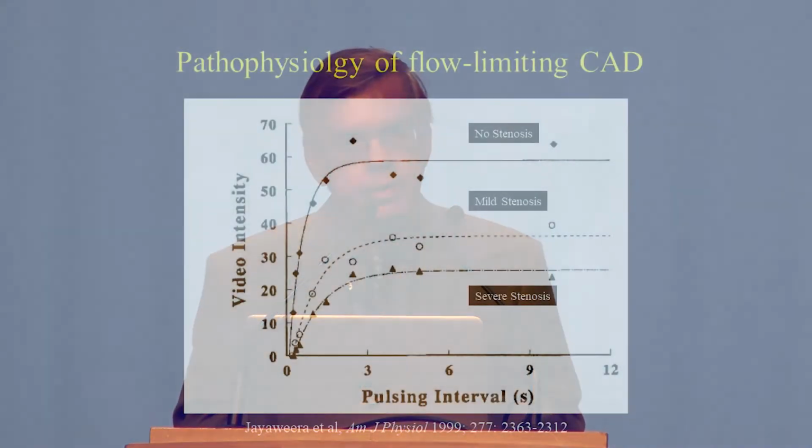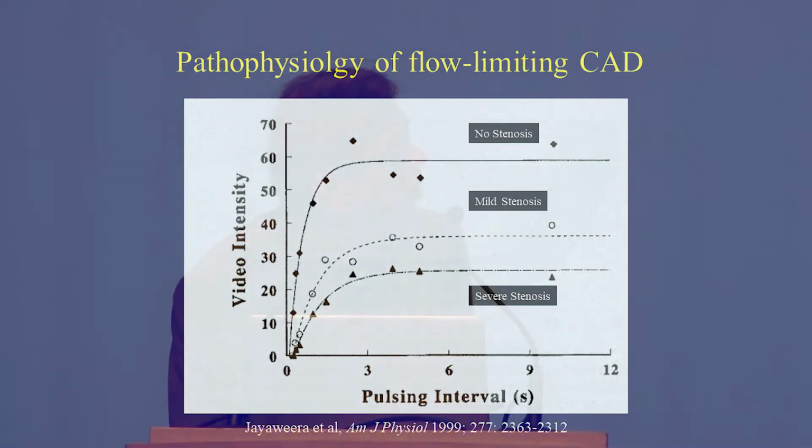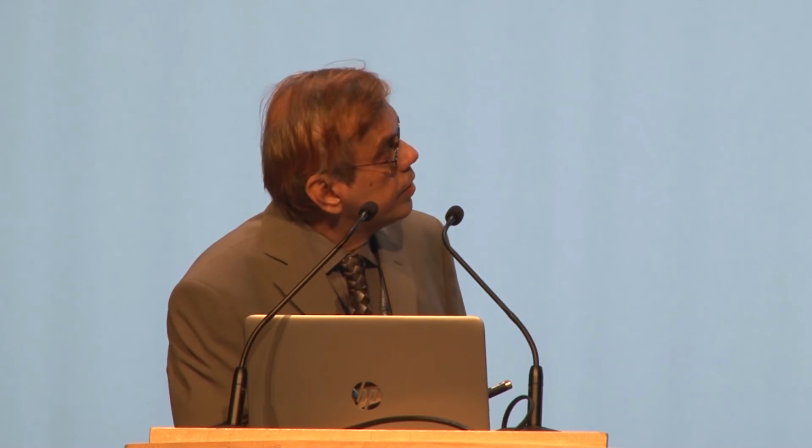So now, in echocardiography, of course, we are busy. We want to do things very, very quickly, right? Because we don't have time. So now in coronary artery disease, the greater the stenosis, the greater the reduction of both the velocity and the capillary blood volume. But there is a difference in the way it appears compared to what I showed you just before.